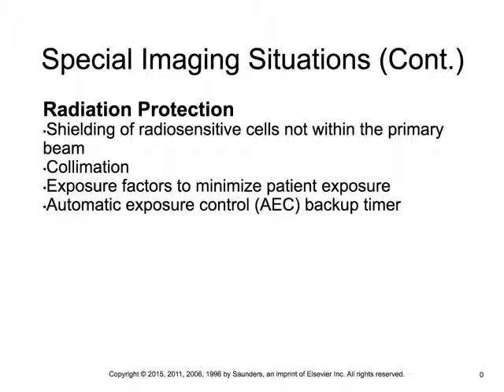We want to use appropriate exposure factors, especially if we're using a CR unit. We know about dose creep. And then with automatic exposure controls, the backup timer should be appropriately set. Anytime we're using an AEC, we should know what that backup timer is set for. Okay?